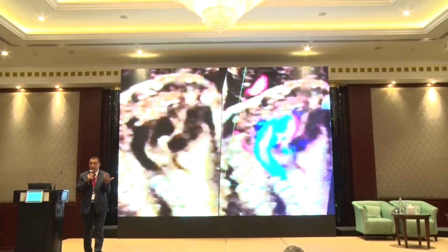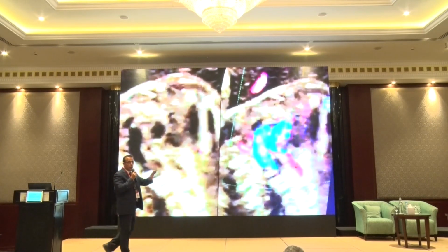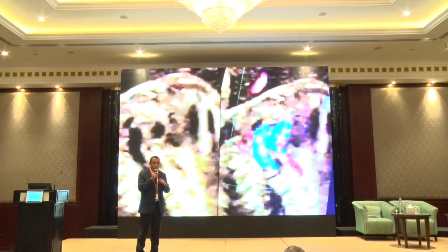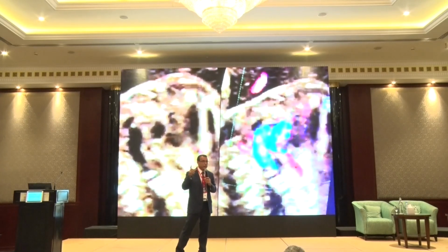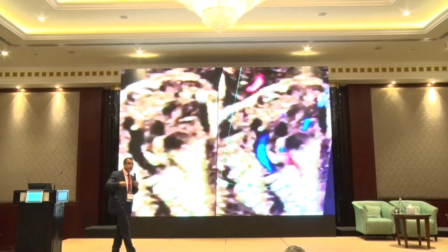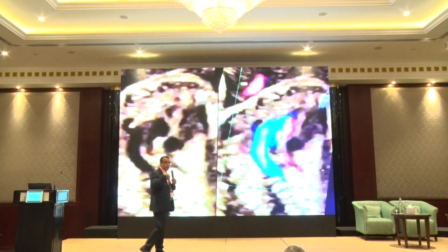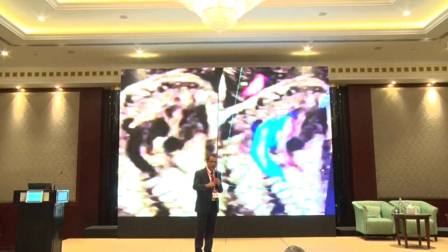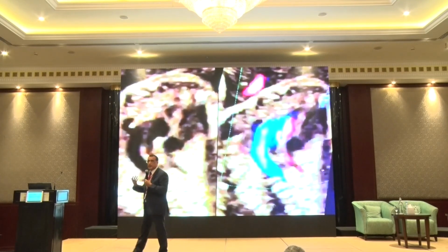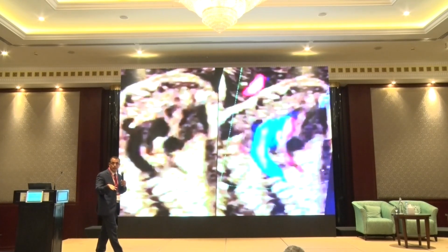Now the pulmonary artery is different. You may miss the whole spectrum of the pulmonary artery. You don't see a pulmonary artery at all. And that's the worst type of what? Tetralogy of Fallot, where you only see the aorta and the branches going to your head, so you are alive, but you don't see anything else. You don't see a PDA. You have nothing in your hand. So where is the patient? How is he going to feed his lung? He has to stay alive after birth, and that patient must have what we call MAPCAs.